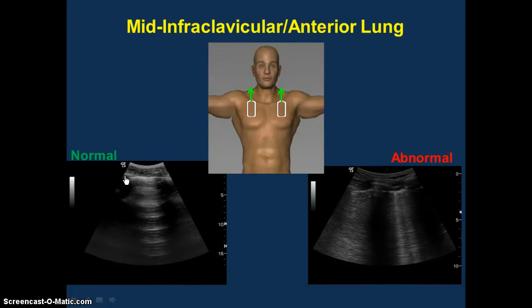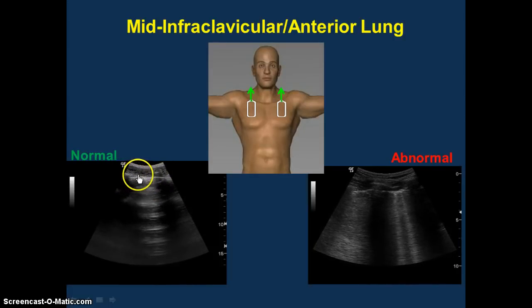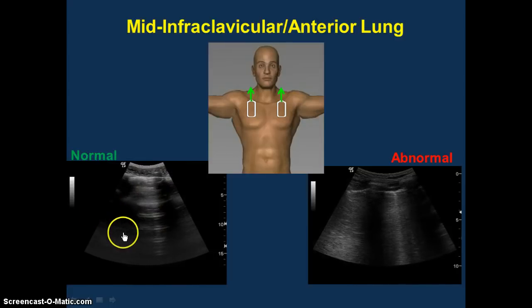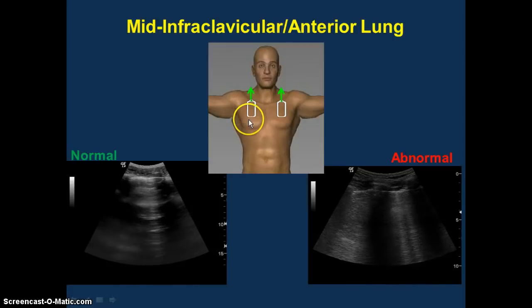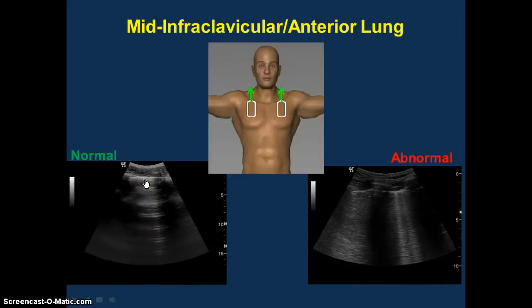If this is all new to you, just go back and take a look at the intro to lung ultrasound on the SONO Internus website. Essentially, here's a rib with shadow, rib with shadow, and this white line here is the pleural line — the interface between the lung and the chest wall — and all up here is chest wall, and all that below is artifact. When you put the probe on the anterior surface of the lung in between the intercostal space to look at the lung parenchyma, this is a normal artifact pattern. This reverberation artifact — horizontal lines coming down from the visceral-parietal pleura — is suggestive of aerated lung.